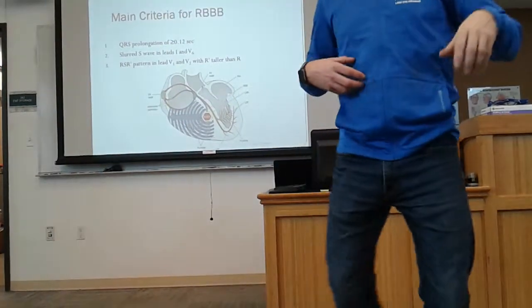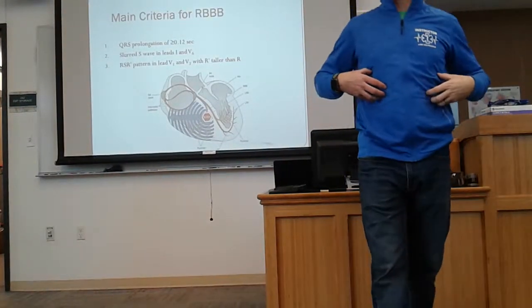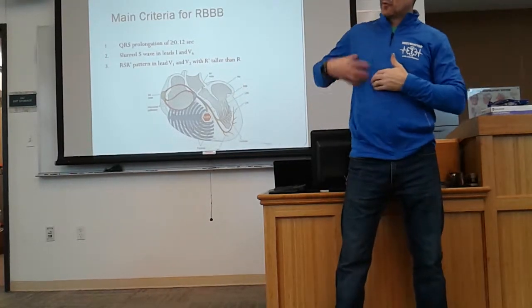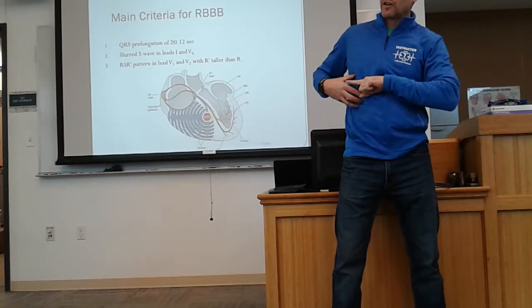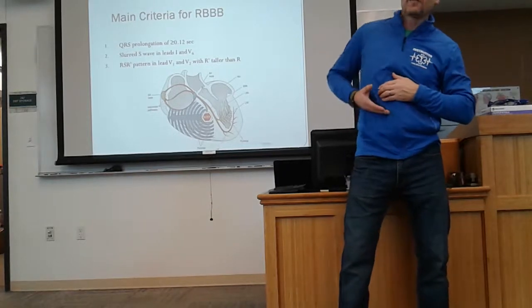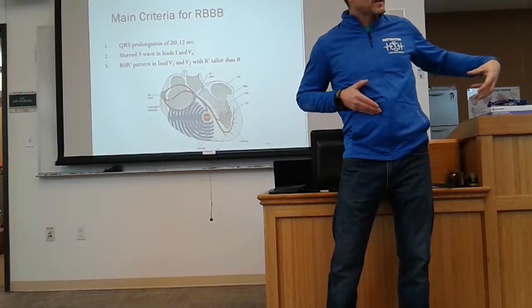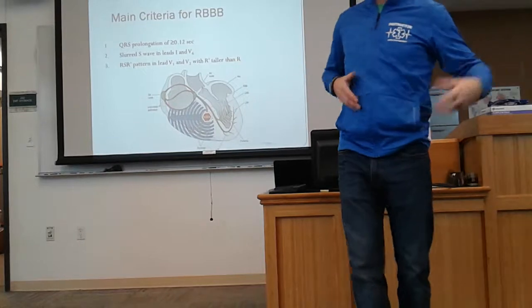Endocardium to epicardium, from the inside of the heart to the outside of the heart. So if it's going from the inside to the outside, and all of the muscle mass for the right ventricle is on the right border of the heart, then from a lead 1 standpoint, what direction is the electrical activity traveling? Away from it. Fantastic.